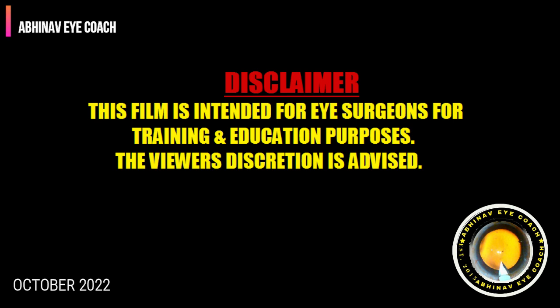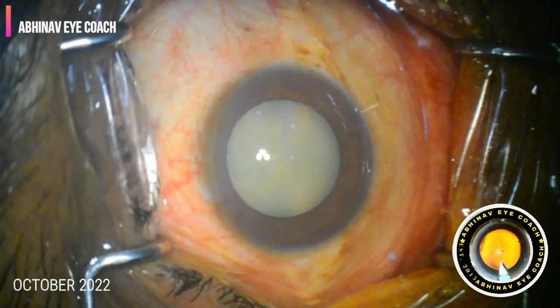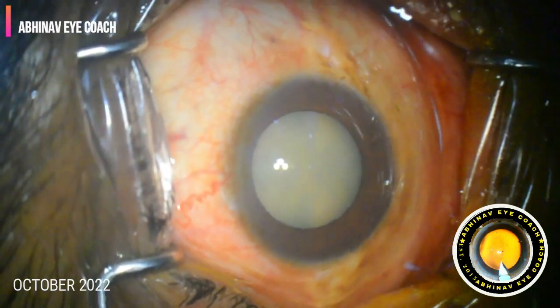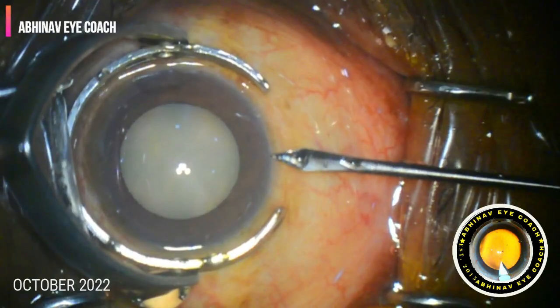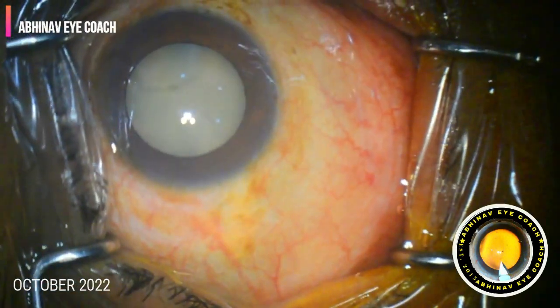This film is intended for eye surgeons for training and education purposes. Viewer discretion is advised. Today we are going to see a routine case of phacoemulsification of hypermature cataract in which a rare complication called snap sign occurs.